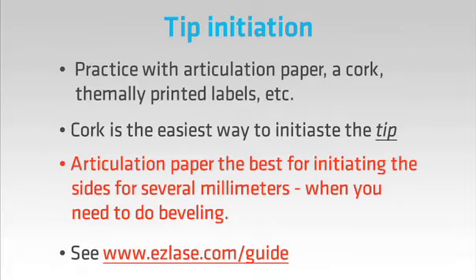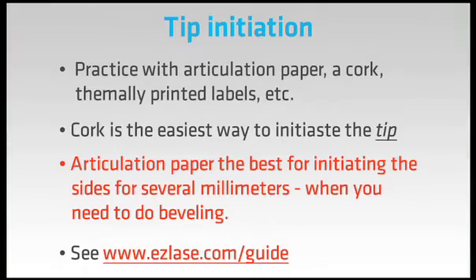Interestingly, one of the most common reasons for service calls for diode lasers is because the user has forgotten to initiate the tip and then tried to cut. All that happens is heating of the surrounding tissue without effective ablation.